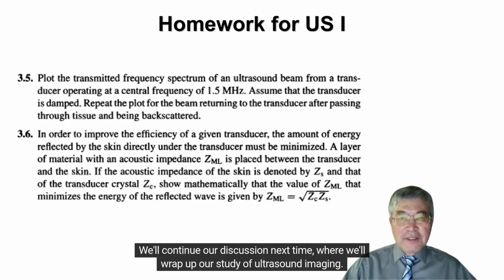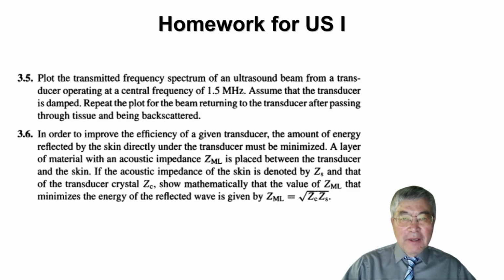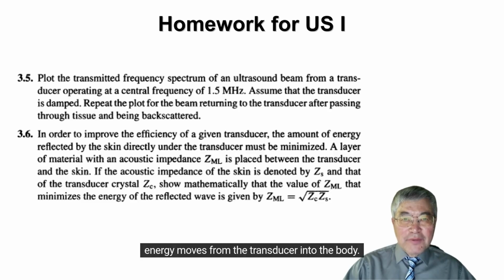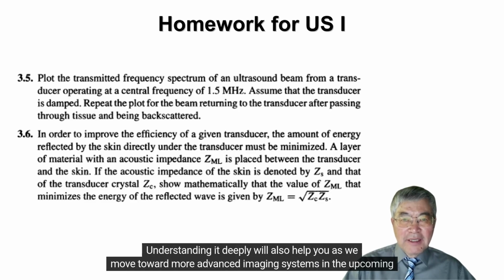We'll continue our discussion next time, where we'll wrap up our study of ultrasound imaging. Remember, the matching layer is crucial both conceptually and practically because it determines how efficiently energy moves from the transducer into the body. Understanding it deeply will also help you as we move toward more advanced imaging systems in the upcoming lectures.